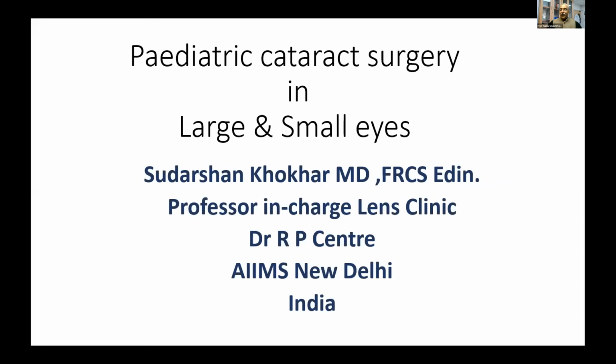Perfect now. So we have just seen beautiful surgeries done by Professor Nihal, and wonderful concepts from Ken Nischel. So let's see what happens when the eye is not the size which you expect. You expect a good size of the eye. If you have a patient of rubella, you might have smaller eyes with a partially absorbed cataract. Of course, you're putting lenses in those ones. So how do you plan these smaller eyes or the bigger eyes?